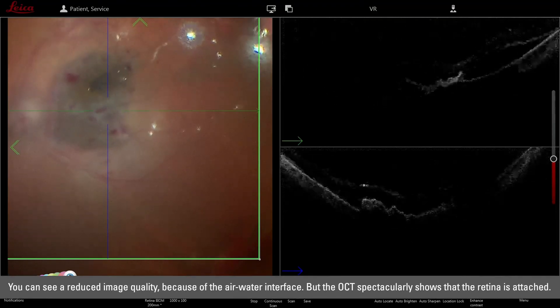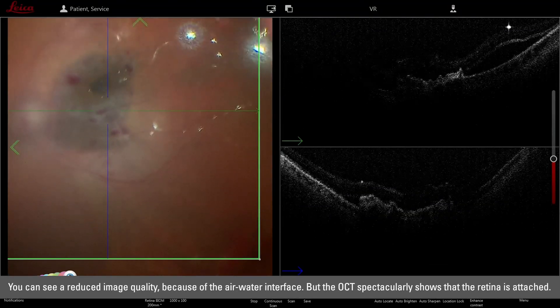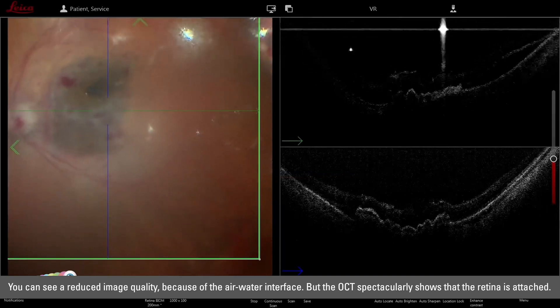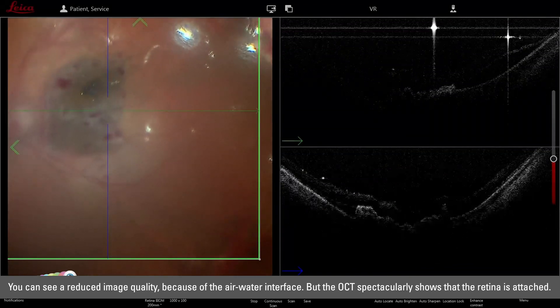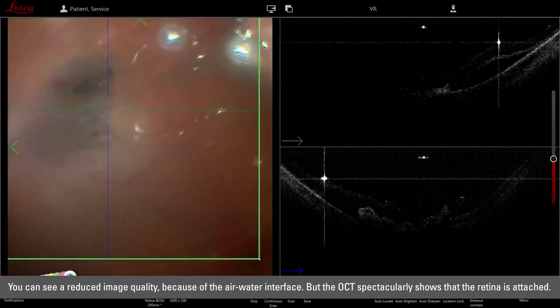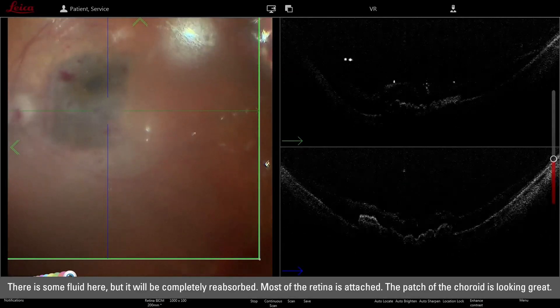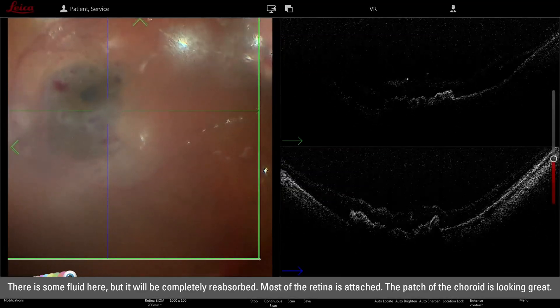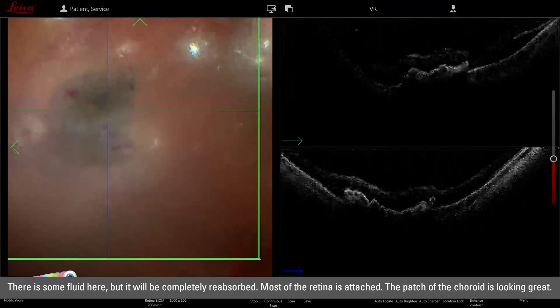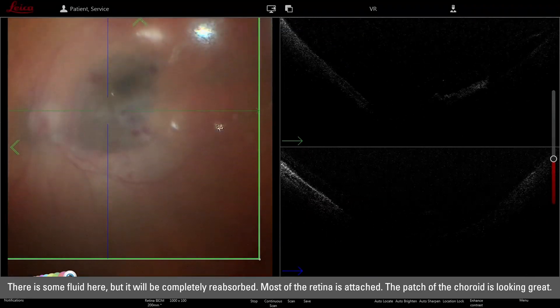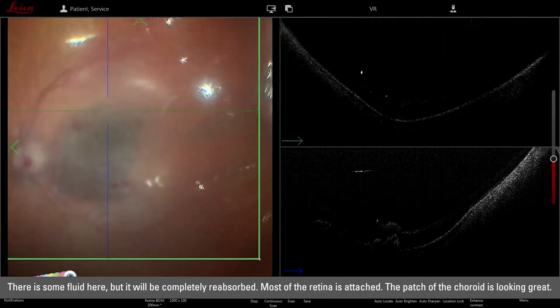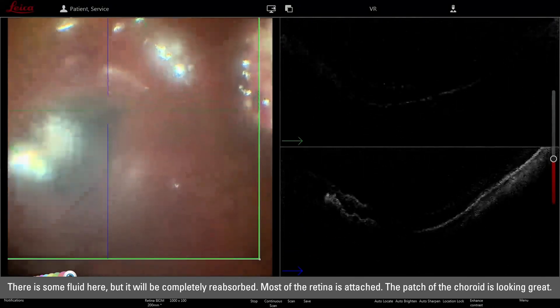The vision through the microscope is low because of the interface, but the OCT can spectacularly show that the retina is attached. I have some fluid here which is totally acceptable — it will be reabsorbed — but most of the retina is attached and the patch of choroid is looking great.